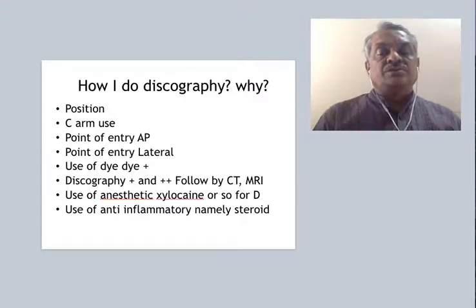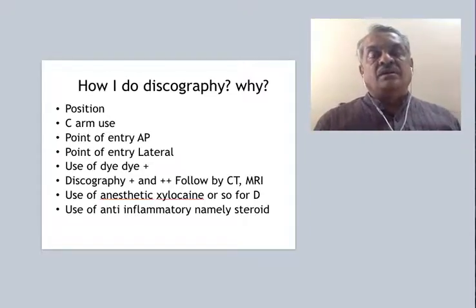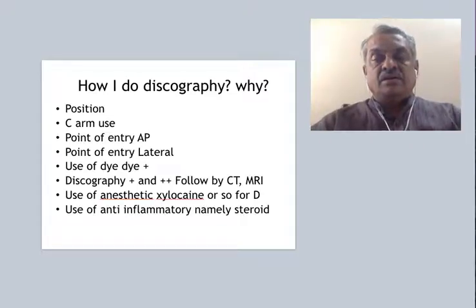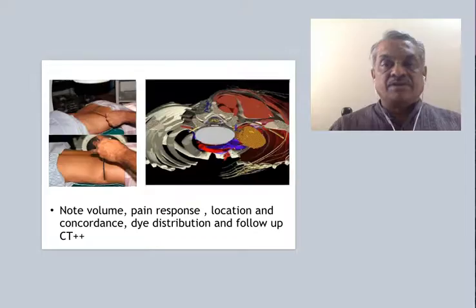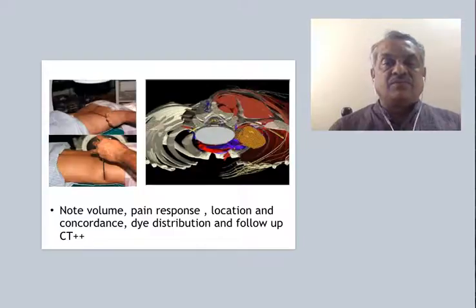We can use anesthetic to find out whether the pain which is elicited by the discogram can be relieved by the use of lidocaine inside the disc. Sometimes we use steroid after we have finished the discogram, and nowadays we have started using a PRP or a PRF after the discography as to decrease the inflammation around the site of pain generation. Now this in short are the images which will clarify what we do.